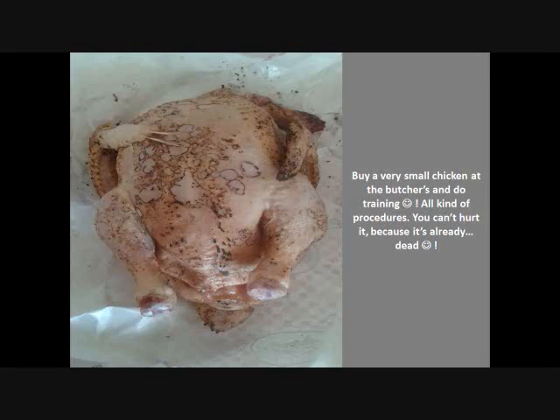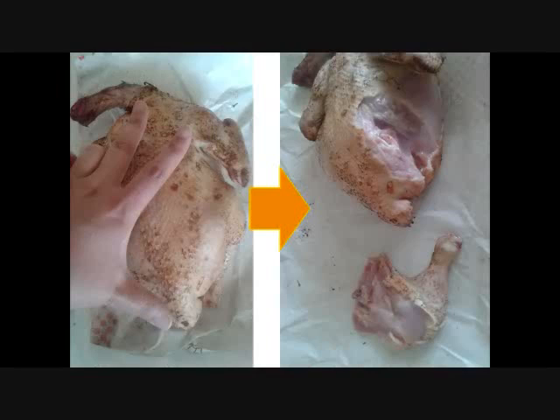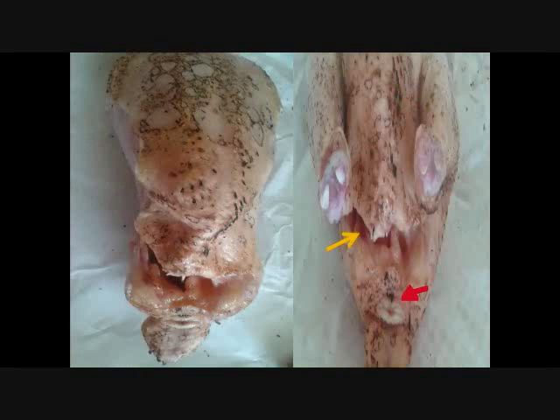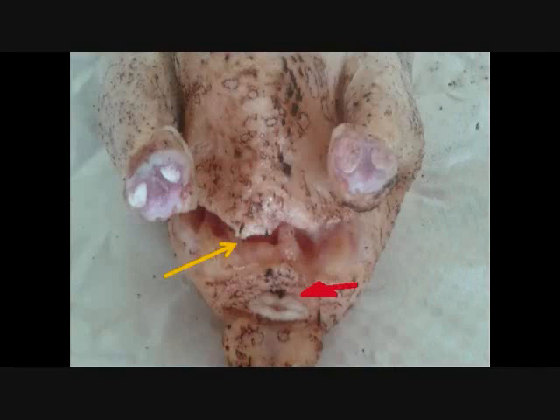I'm just kidding. And as you see, I took off the wings and the legs. Here they are, both the legs and the wings. I'll tell you what I did with those later. And here is where I had to insert the scope. The places indicated by the yellow and the red arrows, especially the red one.